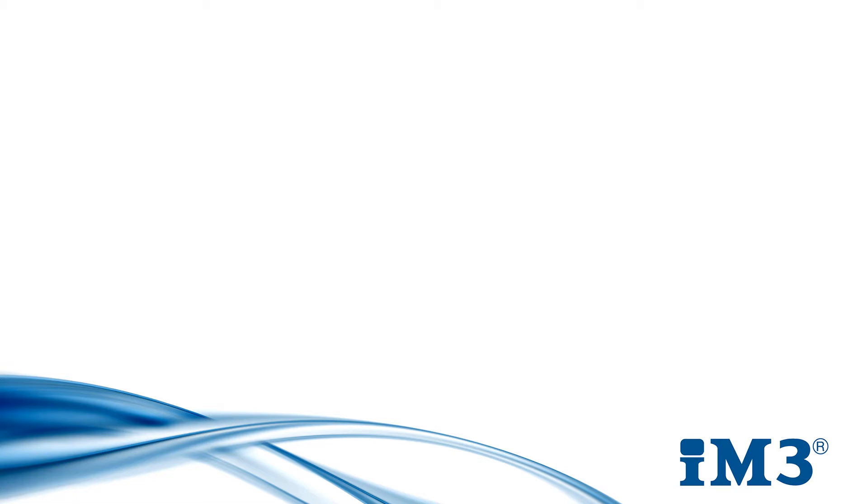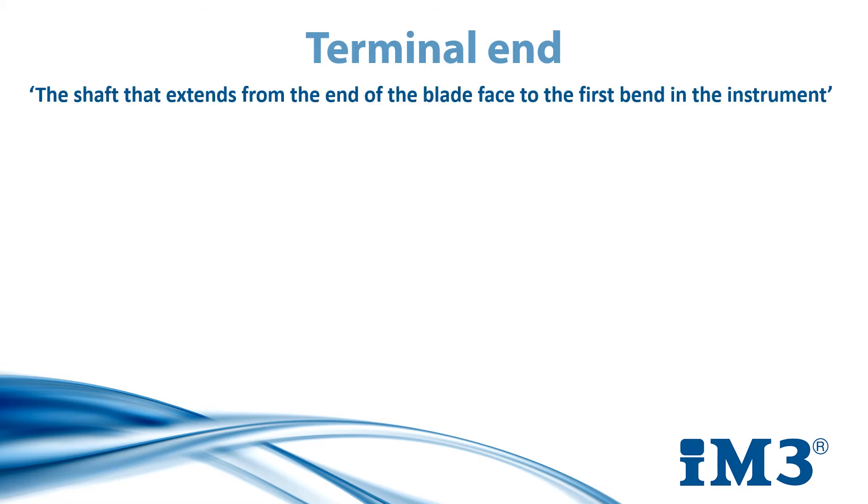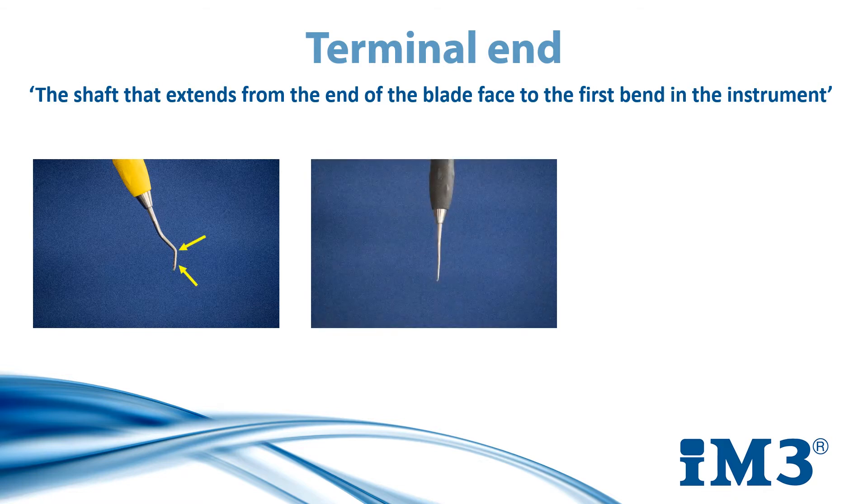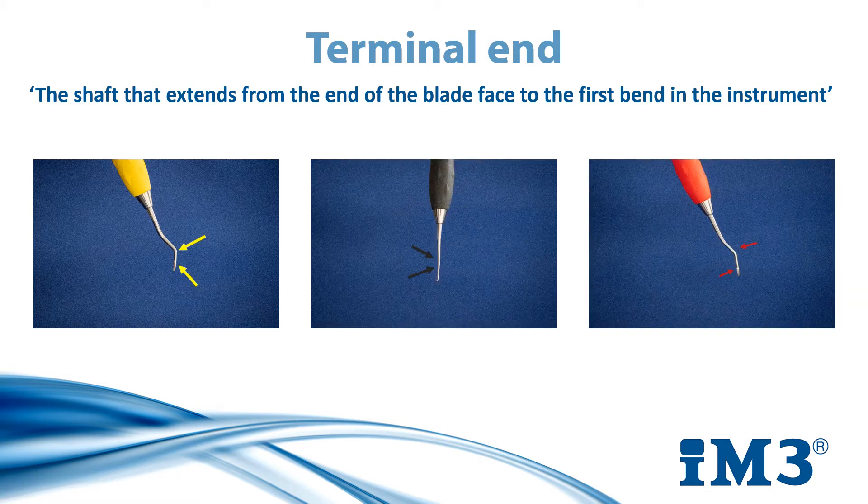We are going to start by looking at how we sharpen our hand scalers and our hand curettes. But before we begin, there is a very important landmark you need to locate on each instrument first. The terminal end is the shaft that extends from the end of the blade face to the first bend in the instrument. It varies for each instrument, but the same principle applies. You can see on screen we have our universal curette on the left, our Gracie curette in the middle, and our universal scaler on the right. The terminal end is the shaft located between each of the arrow points.